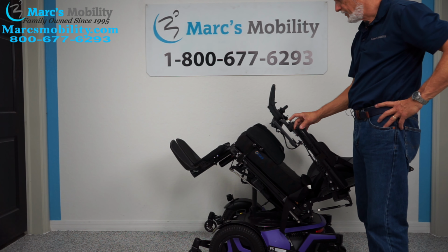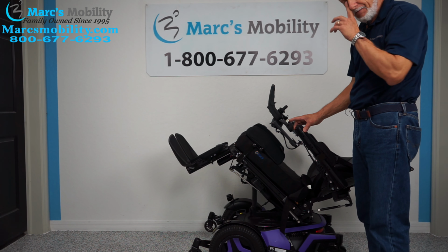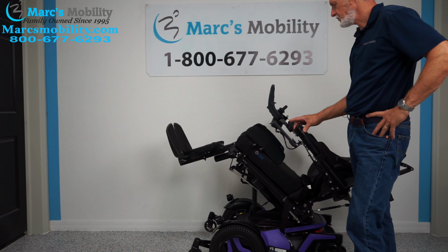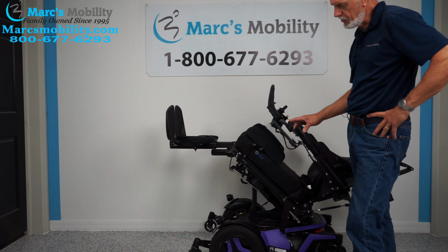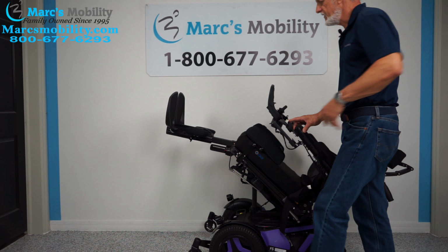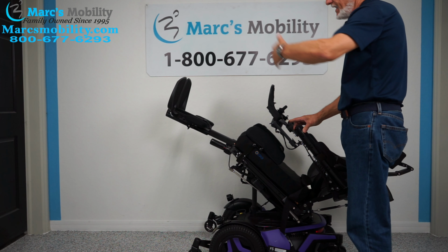And the next thing I'm going to show are the feet. So these feet right here, they're going to go up. So if you needed some good circulation, you could do it this way. I'm going to show you the extreme position so you have a good idea. And you can see this motor right here right now. This motor also helps the legs go in and out.